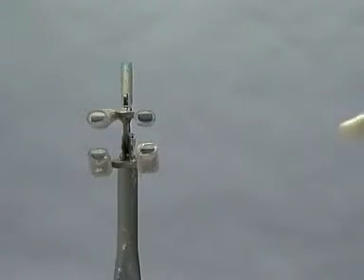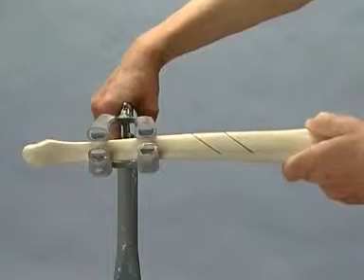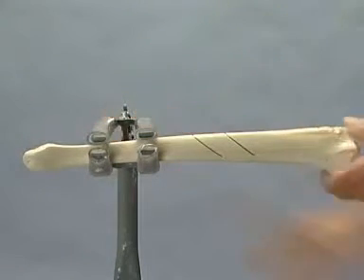The cortex lag screw. The distal part of the bone is clamped into the vise. The proximal cut in the bone will be used.